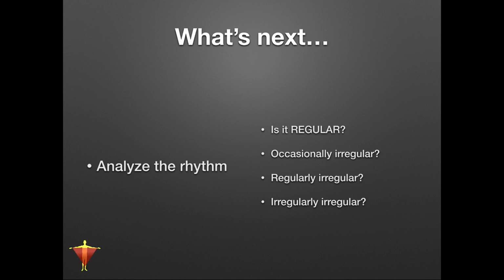When we're trying to calculate the rate, we just have to sit there, palpating a pulse. So again, those are things that we're going to be looking at. Is it regular? Well, that generally tells us that everything's looking good. Is it irregularly irregular? This is how we would identify something like AFib, right? AFib is irregularly irregular. So just something to be able to give a name to the rhythm.